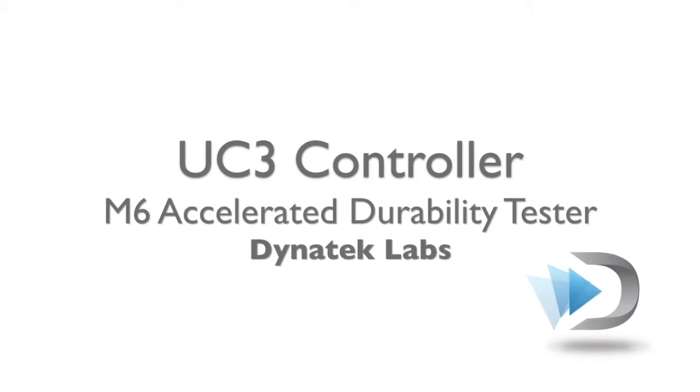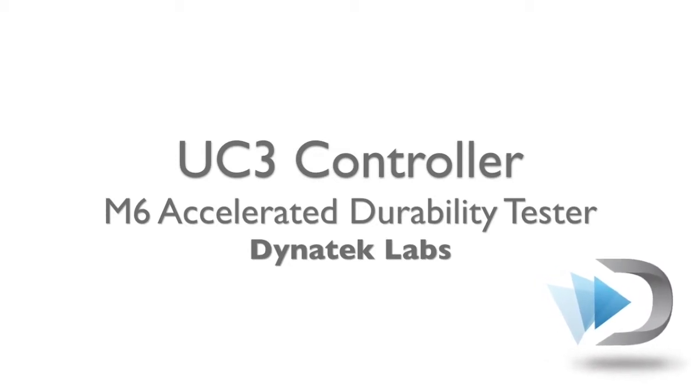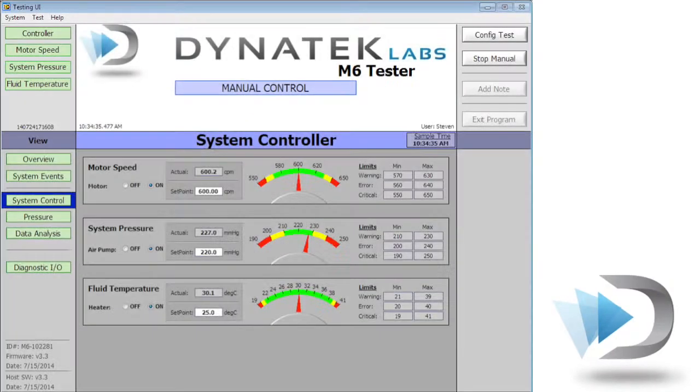This is a demonstration of Dynatec Lab's UC3 controller. The software has been created for the M6 Accelerated Durability Tester, designed for heart valves. The M6 UC3 controller combines the latest in data acquisition and control available.